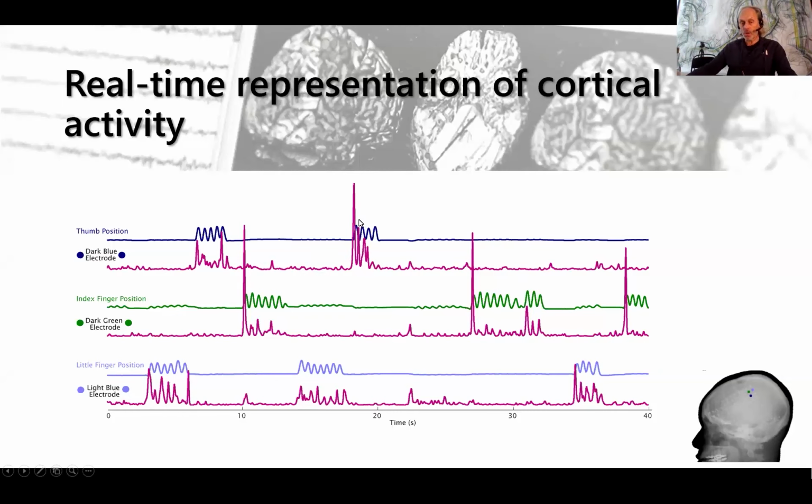There's a lot of high gamma activation occurring because it's a new task for the patient. And then with every single repetition, it gets smaller and smaller because you don't need your cortex anymore. The spinal cord takes over. And this is very important information for designing brain-computer interface experiments. So if you're doing repetitive finger movements, you don't need your cortex anymore.